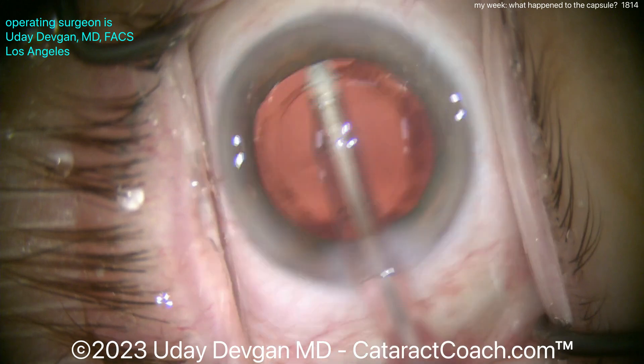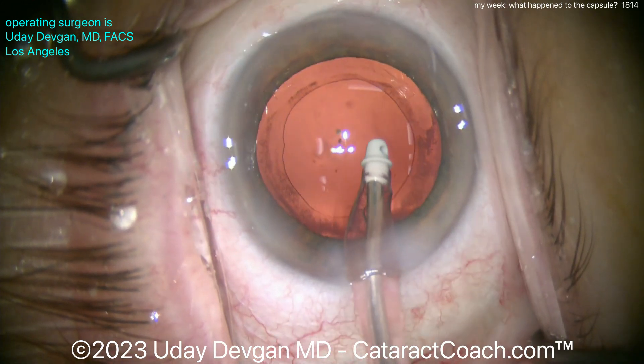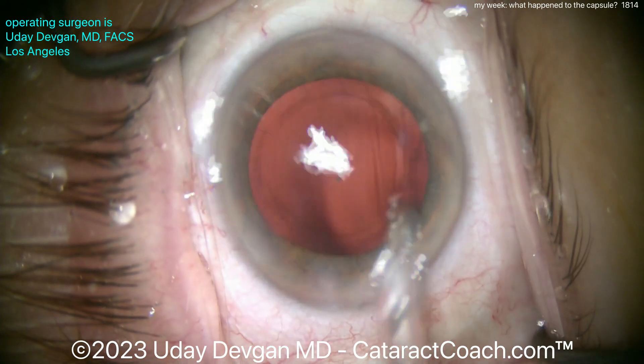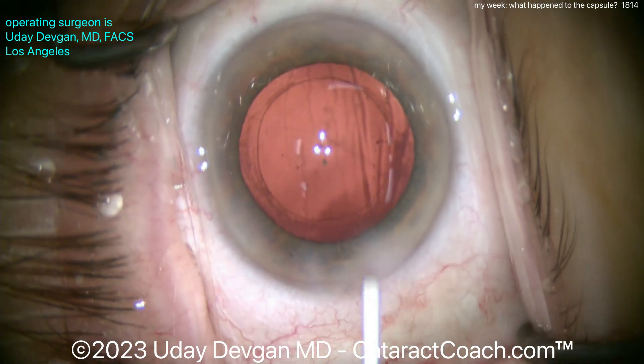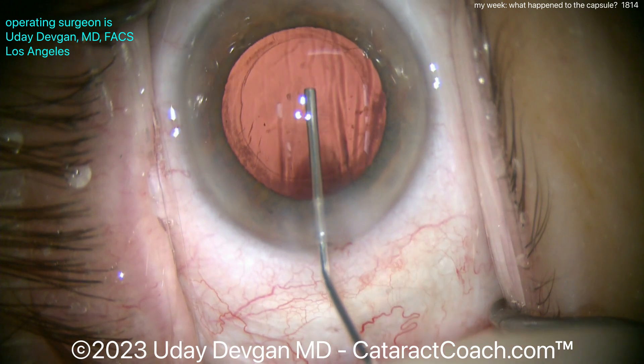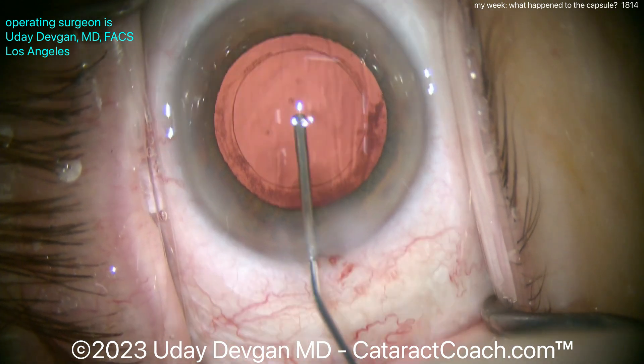We'll polish up here, aspirating underneath the anterior capsule rim. You can see there is some zonular laxity. If you look carefully, there are some tiny lens chips that got behind the posterior capsule through a gap in zonular support and into the anterior hyaloid space.